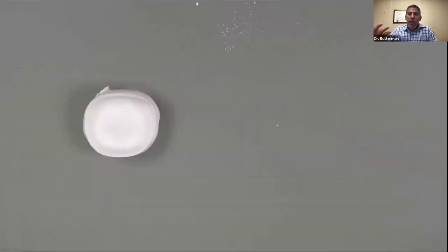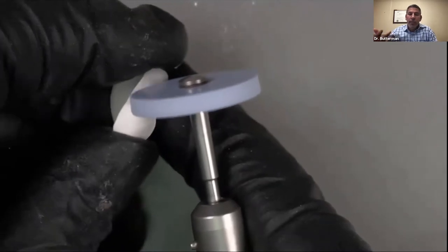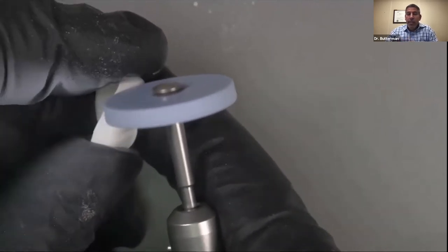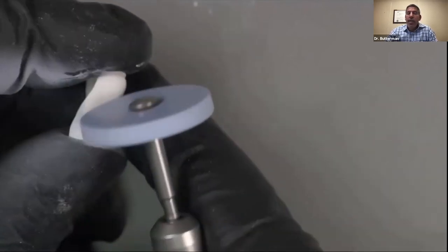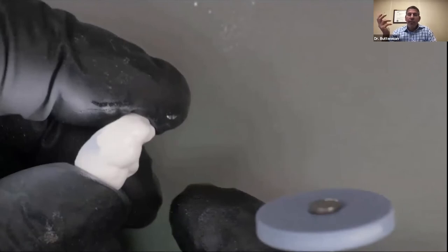Don't break your crown off the block. I want you to cut it off the block with a lab handpiece. And it's probably a good idea to put something up underneath when it comes off. And then we're going to remove the sprue, remove the excess, lots of different ways to do that. So we're just going to take off the gross part of the sprue that's left, and we just want to lightly polish the surface underneath it. Now, if some of you want to take it at this point and just put it in your oven and sinter it and polish it afterwards, fine, fine. You're not going to cause any risk. You're not going to cause any damage. You're just going to have more work to do afterwards.